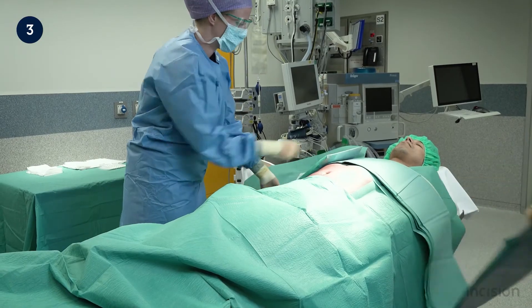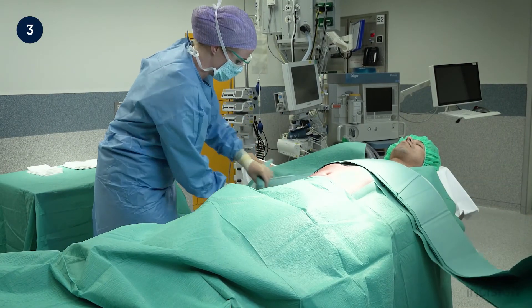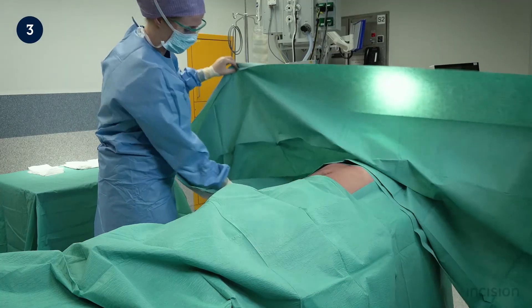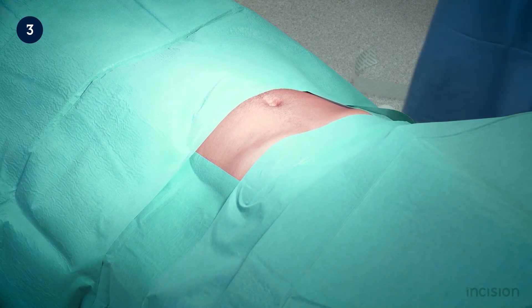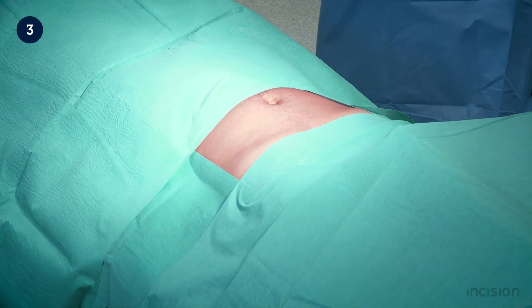Take note that typically this larger drape will be placed over an anaesthetic stand, a surgical table accessory. This was not done in this film to allow maximum visibility. Square draping of the abdomen is now complete.